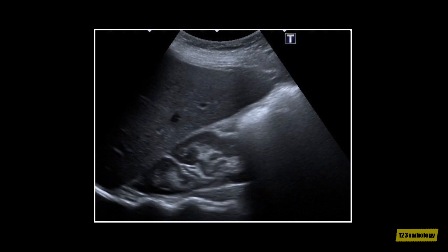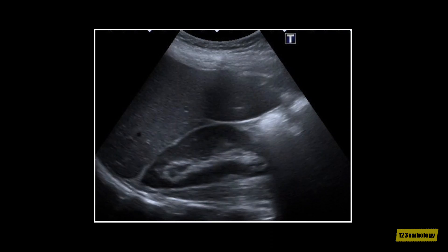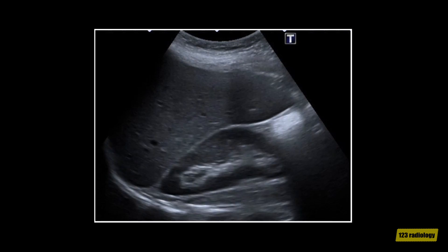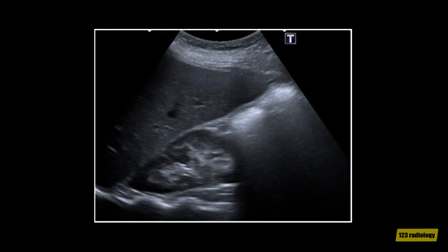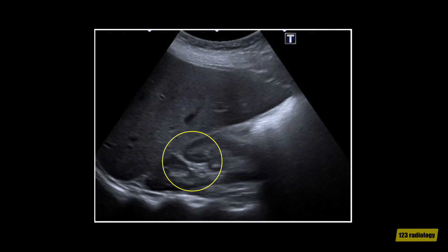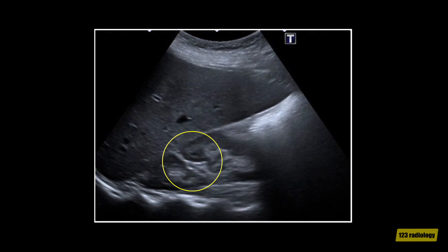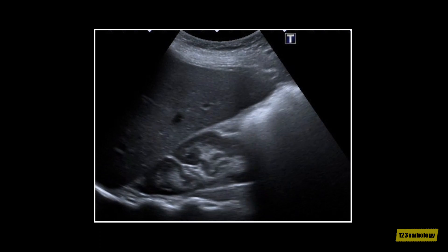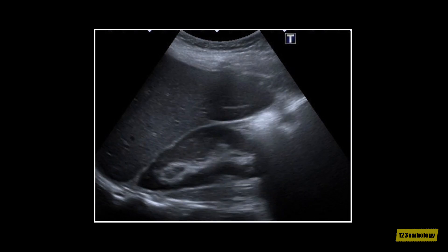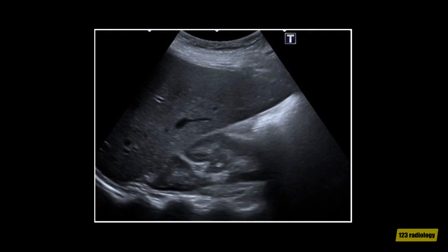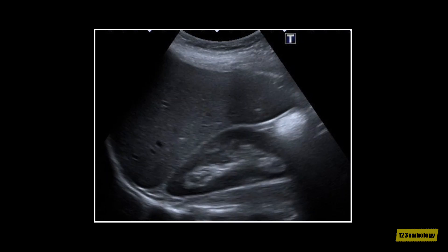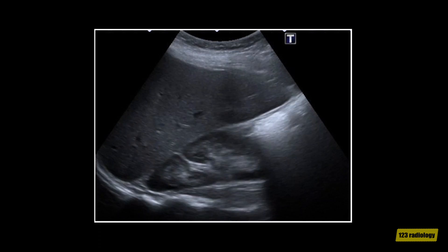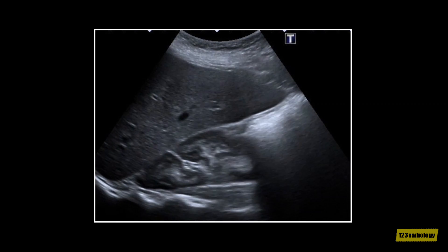This video clip shows a case of junctional parenchymal defect. This is a longitudinal view of the right kidney. It shows an echogenic line extending from the anterosuperior aspect of the kidney into the sinus fat. This is a characteristic location for a junctional parenchymal defect. No associated parenchymal loss was seen, which confirms the diagnosis and excludes cortical scarring.